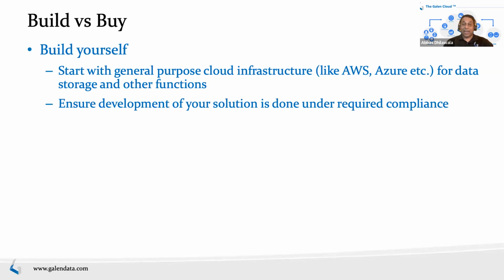Again, this whole lifecycle aspect is important in any software development. Security configuration: a lot of these general purpose infrastructure target a wide variety of users, so the security configuration may not be what you need, right? For example, AWS may say, we are HIPAA compliant. Generally that means they have controls that can be enabled to be HIPAA compliant, but they may not be on by default. So you have to know what those controls are, and make sure those controls are configured properly.